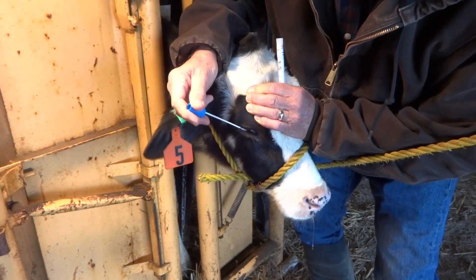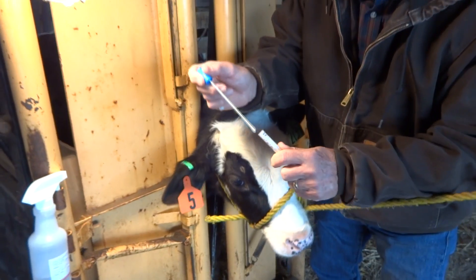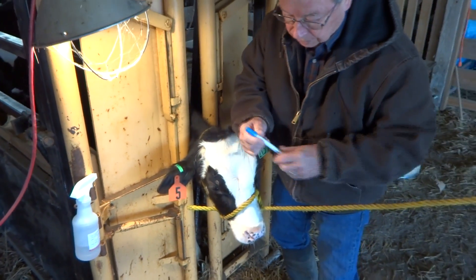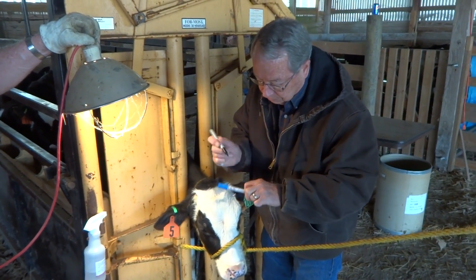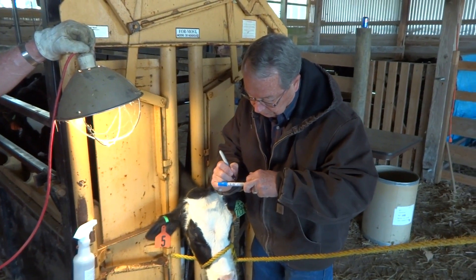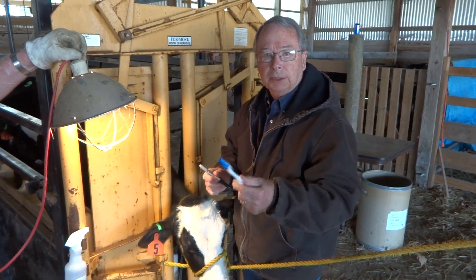You can see that is not showing great discomfort to the calf by any means. It's finished — put it into the medium, use a pen to label it, and we'll put that in a cold pack and it will be shipped to the laboratory.